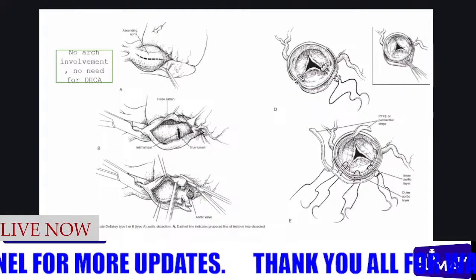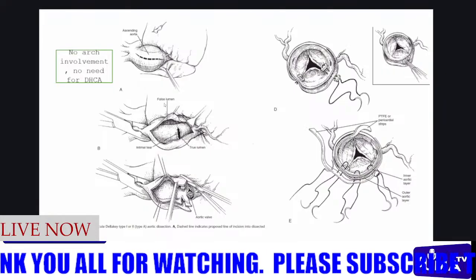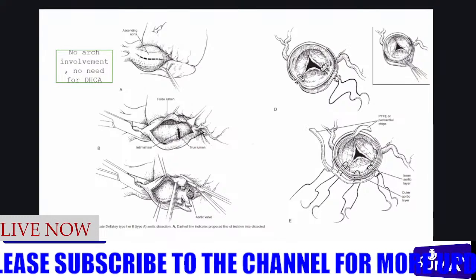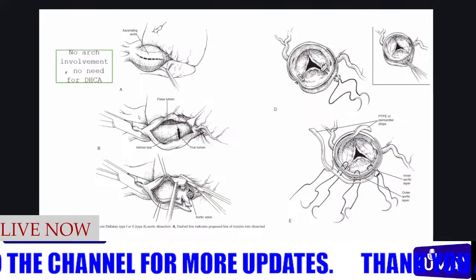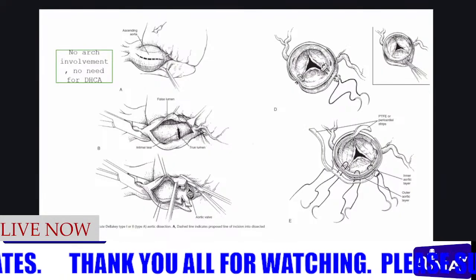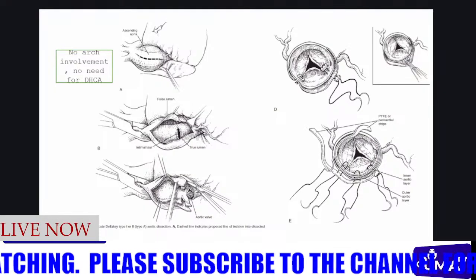So what we do is you open, after you've gone on pump, you've done all those things I've talked about, and you usually have this picture. You see this clamp here, this is just telling you the limit. But also you clamp there and then you connect your cannula somewhere above to provide circulation to the system. So when you open, you will see two lumens. You have opened the false lumen, then the true lumen. You're able to see the one that is covered, that is still encircled by the intima.